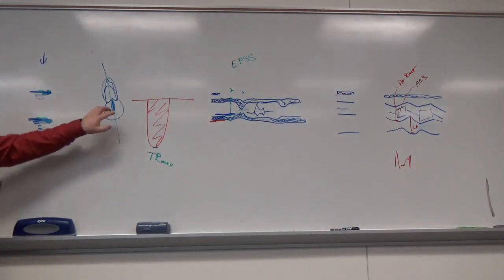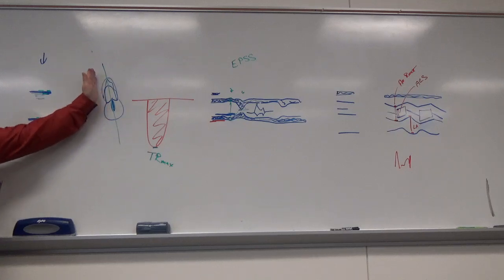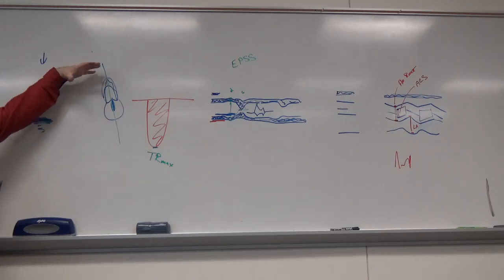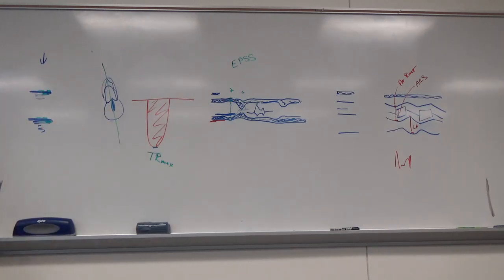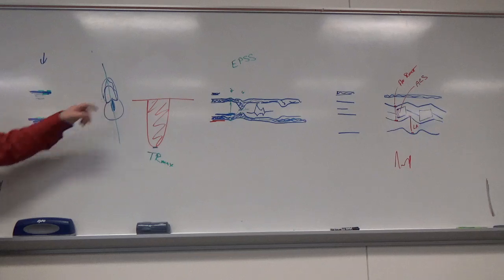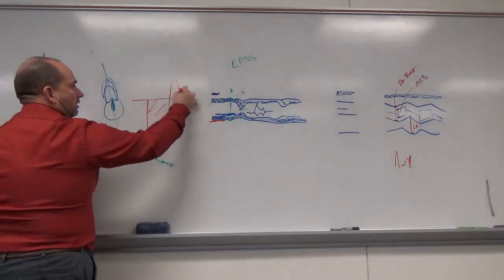Because the flow is coming from the atria to the ventricle. The normal flow is going in that way. We're looking for regurgitation when the valve's shut. So this is now squeezing and it's leaking back. If we looked at the inflow, we'd be on that side of the valve and we would see, like the mitral valve, an E and an A wave.